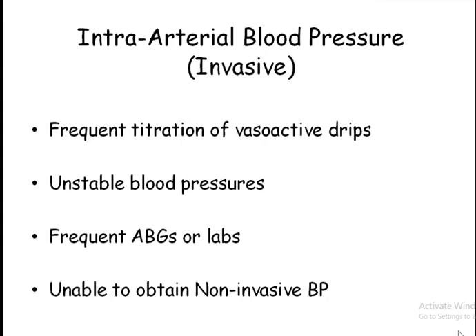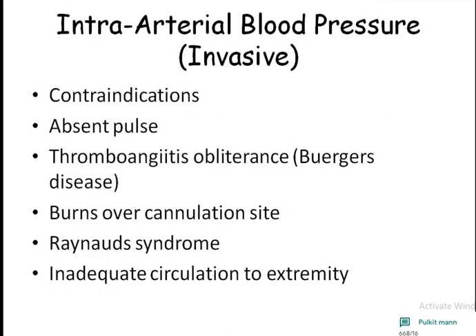And again, if you are not able to record BP on non-invasive blood pressure monitoring. So what are the contraindications? Before doing any procedure, you should know the indications and the contraindications, and then proceed towards how to do that procedure and how to manage the complications which can appear while doing that procedure.